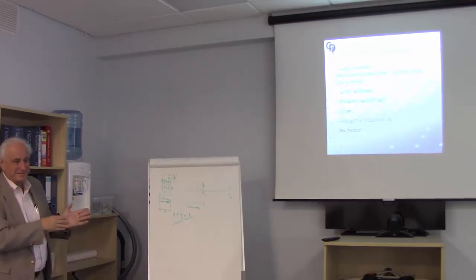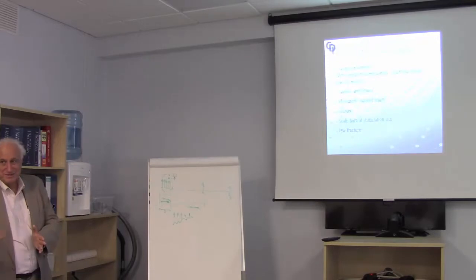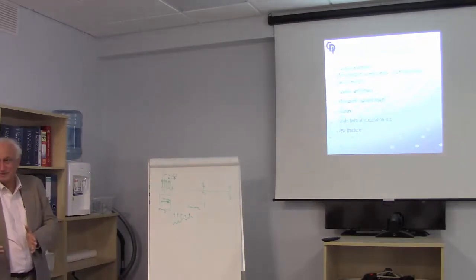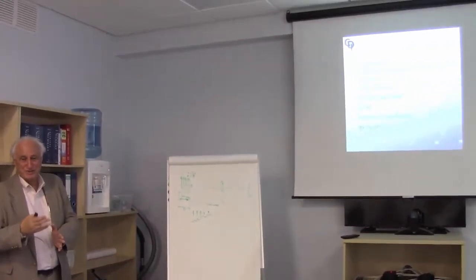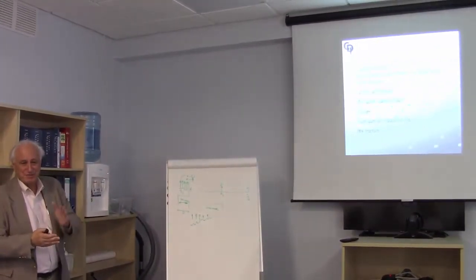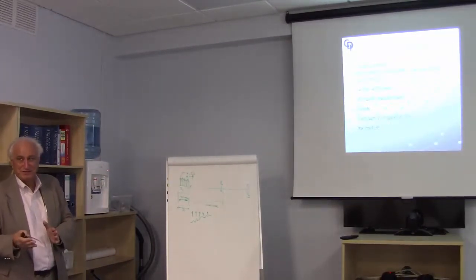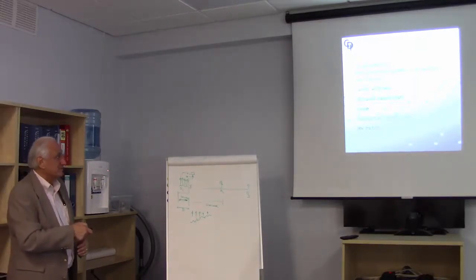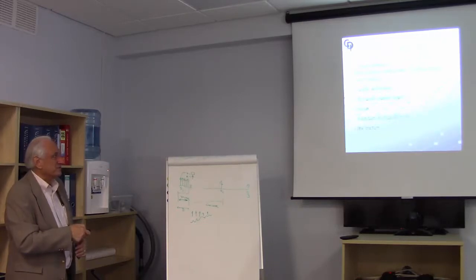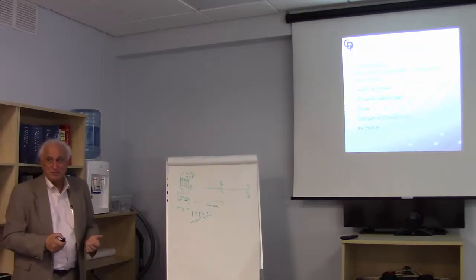And then, depending on the patient, you can get some big extremity movements. That's where you end up adjusting the strength of the stimulus. You want to have a strong enough stimulus to get a response, but you don't want to have them flailing all over the place. So this is really important. Number one, I'd make that number two. The seizure issue, it's talked about all the time in the United States.